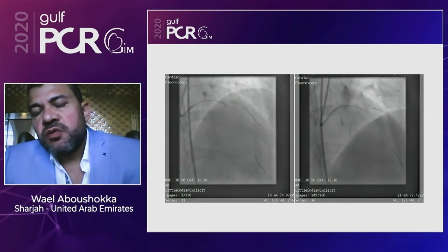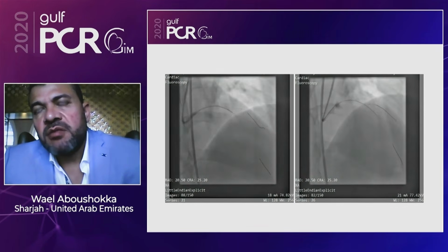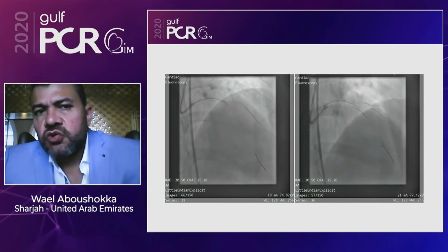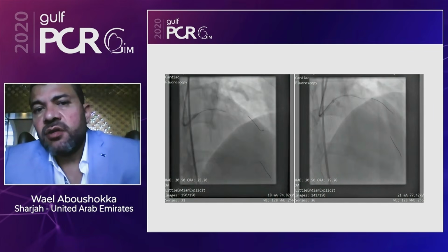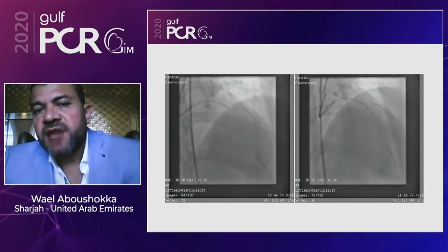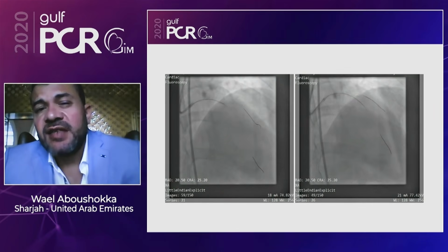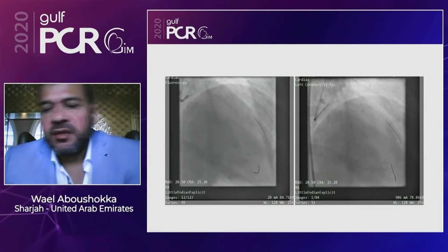And for the orbital atherectomy, you usually do 1 millimeter per second advancement, and you need to use all your senses, the tactile sensation and the hearing also. Once you hear the sound of the atherectomy device change, then you might leave it to work more at this area because there's a lot of calcium, until the sound starts to come back to normal a little bit.